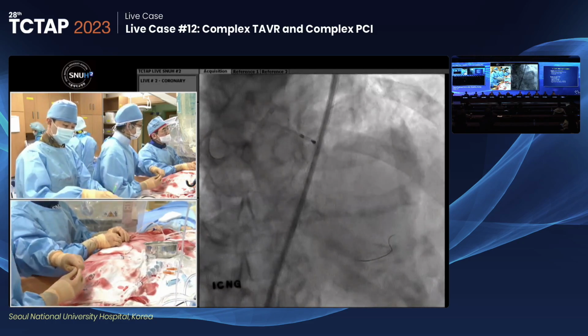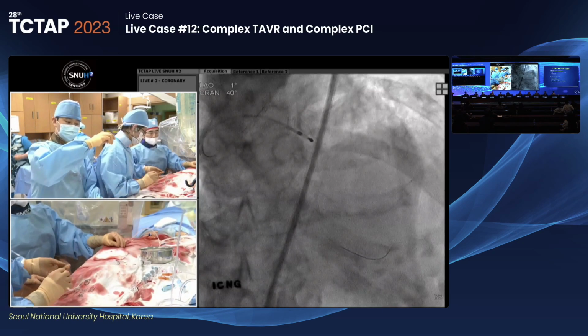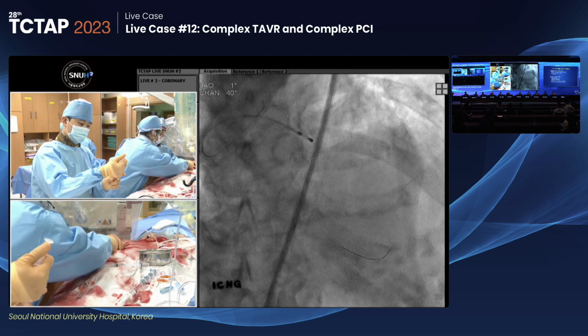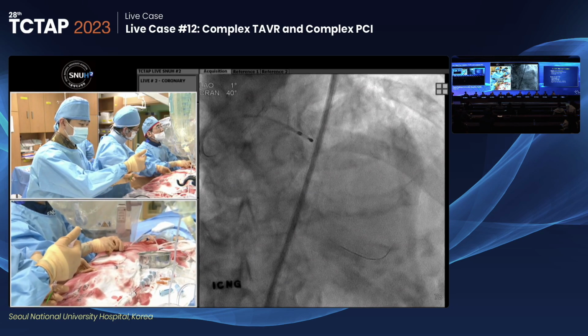The concern is that the blood pressure is not high enough to do the procedure very aggressively. On the backup of dopamine 20, the blood pressure is not below 100.